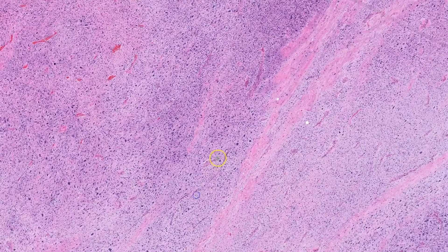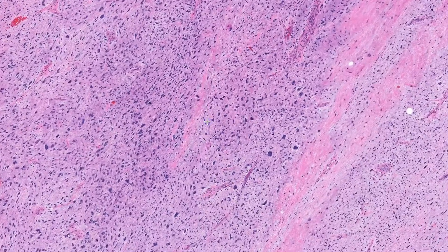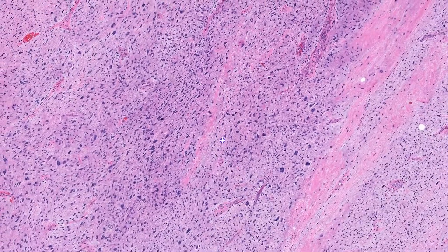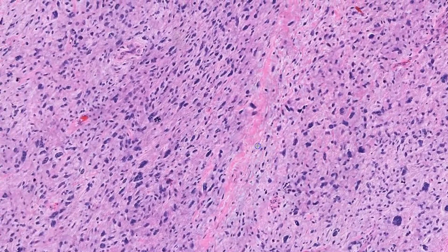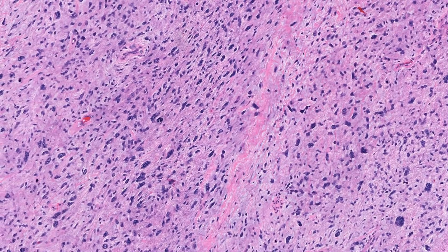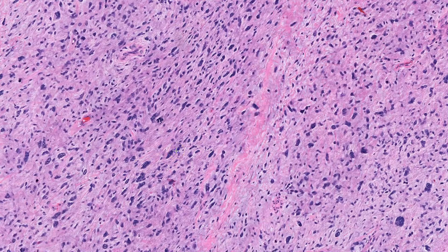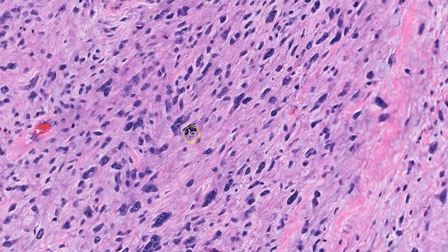Looking more at the cells themselves, you can see there is really a spectacular amount of atypia with pleomorphism, hyperchromasia, irregular nuclear membranes, coarse chromatin, and even multinucleation. Mitotic figures, including atypical ones, are easy to find, such as this one right here.